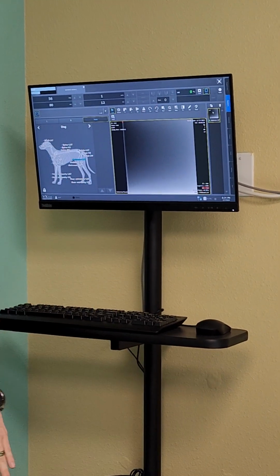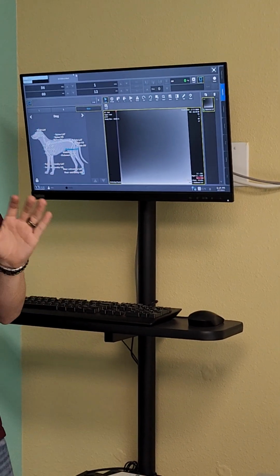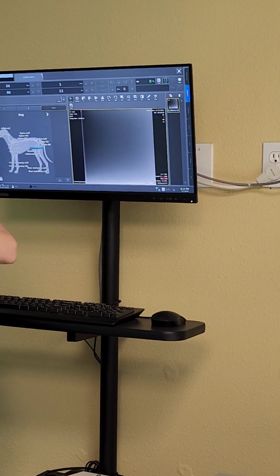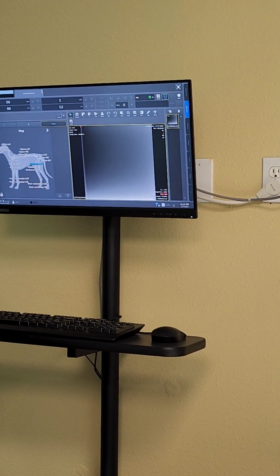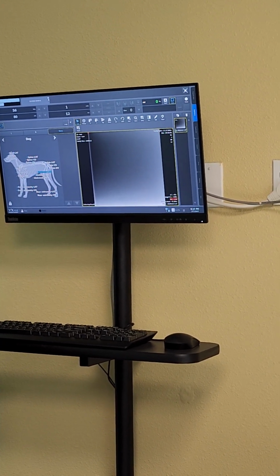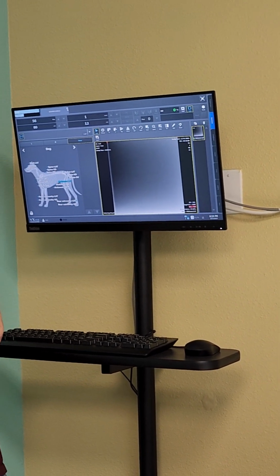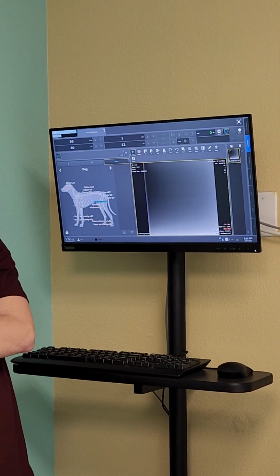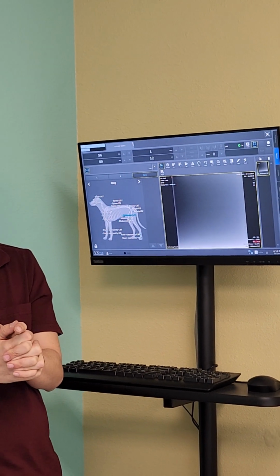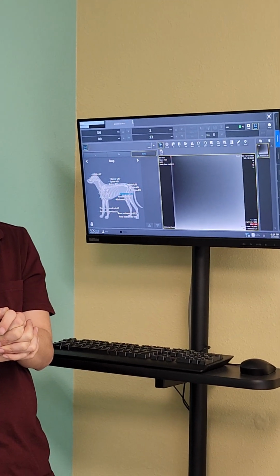So if you take multiple images, and you're finished with your study, you're going to click this X up here, and that's going to send all your images automatically. So you don't have to send each one by themselves. If you want to send to a different place than you normally do, then you can send and select where you want to send it. If you reject one, then when you close out of it, it won't send the rejected image to the PACS system. Correct.